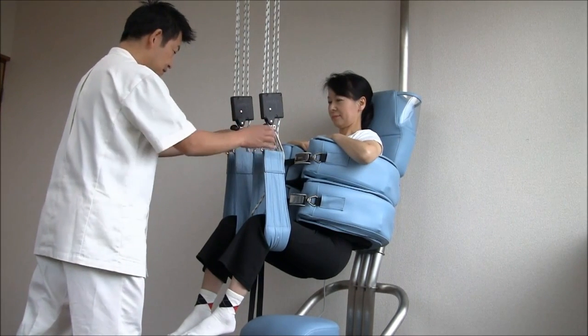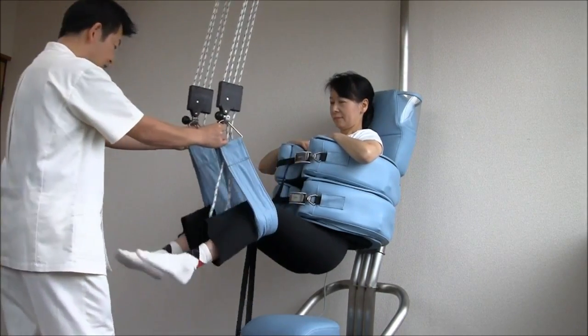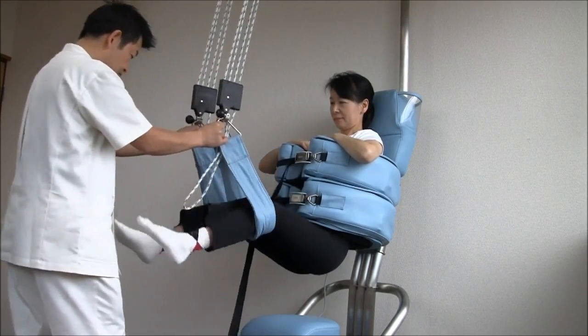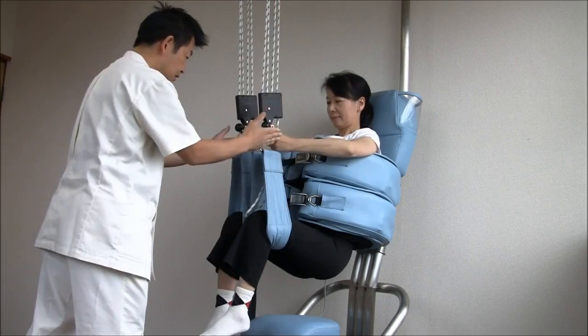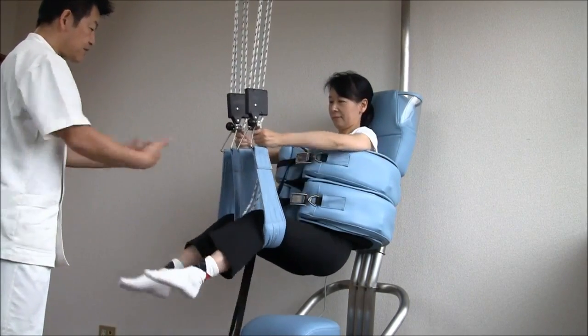Chapter 5. Self-training. It's kind of like a swing in a park. Here, we'll show you how it's done. You swing in and then out. Have them do the swinging themselves.